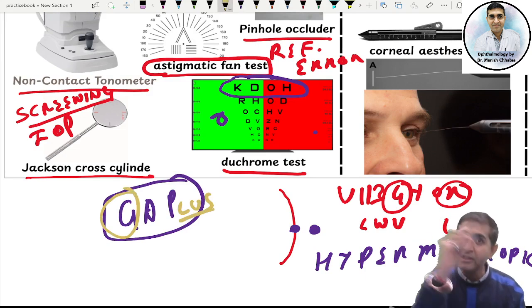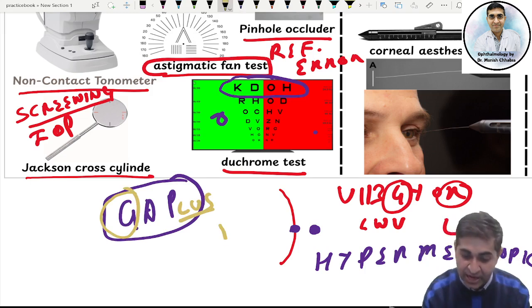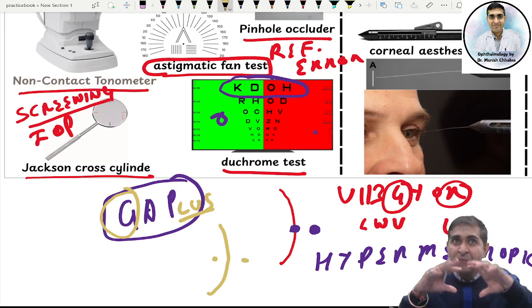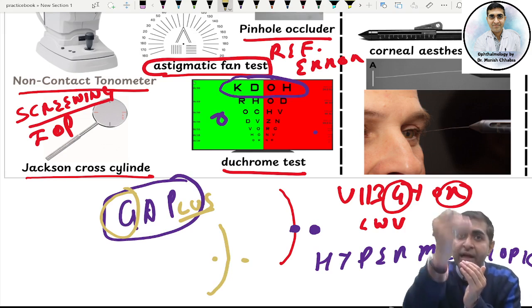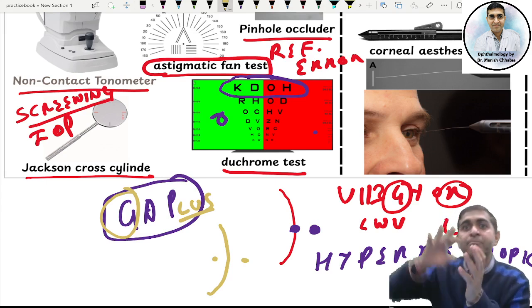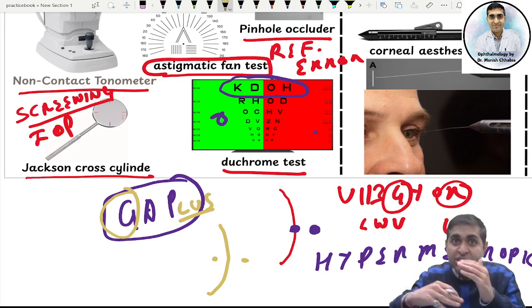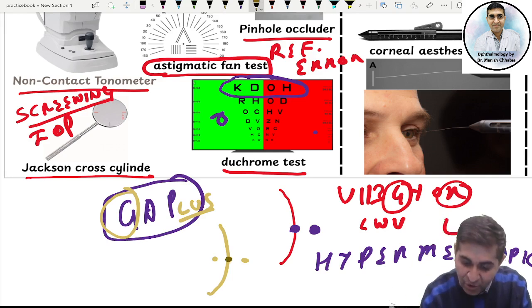Yes. Now what if the patient is seeing red color clearly? Ideally I told you, green color is normally projected in front of the retina, red color is normally projected behind the retina. Ideally both should be the same, because the more anterior green is, the same posterior red is. But when the patient says that the patient is able to perceive the red image better than the green, that actually tells me that red is not behind the retina, red is on the retina.